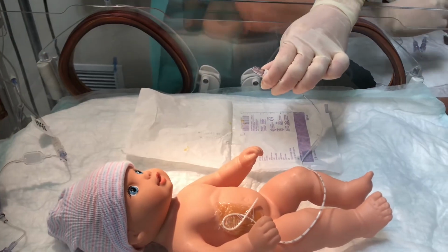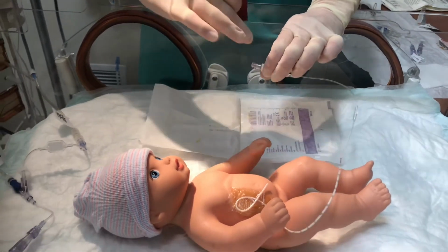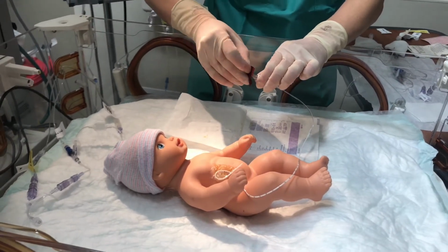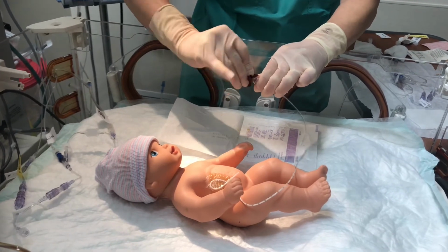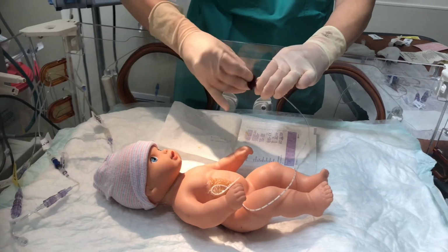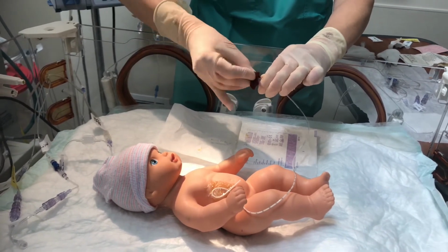Now we're going to vigorously scrub the central line clave, including that connection if you need to change this after 8 days, with betadine times 30 seconds. And this is a different practice than we've done before. So the important part is we're vigorously scrubbing this for 30 seconds. All right, so let's say that was 30 seconds.